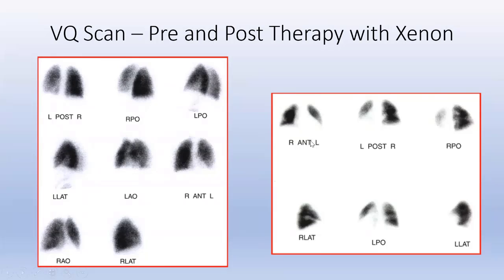And when they return, compare the images. As you can see, the defects are now gone. Let's look at anterior. Where's the anterior? Here you had a sort of a chunk and a chunk. Looks nice. There's no rat bites or anything like that here.